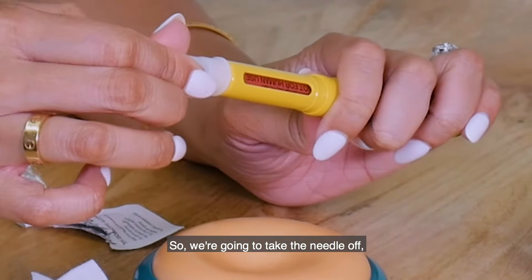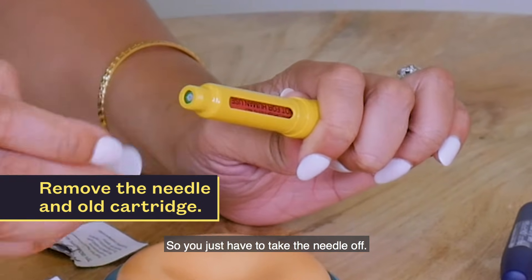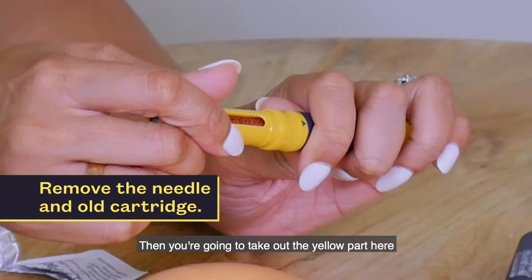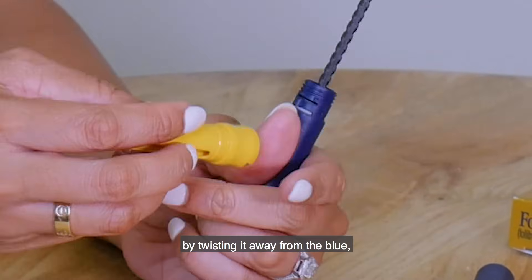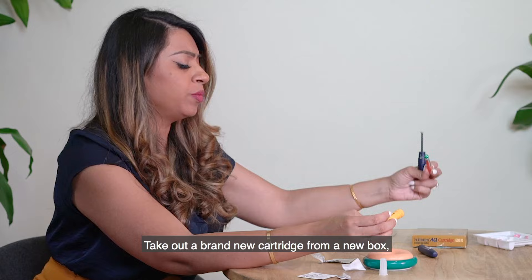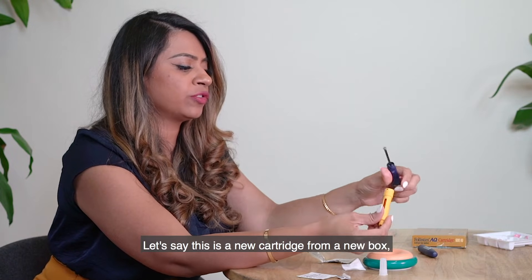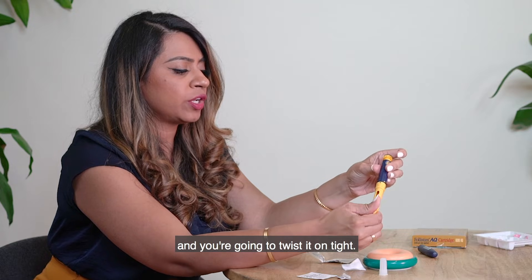To change the cartridge, first take the needle off. Then twist the yellow part away from the blue to separate the pen. Take the finished cartridge and throw it in the trash. Take out a brand new cartridge from a new box, place it into your pen, and twist it on tight.